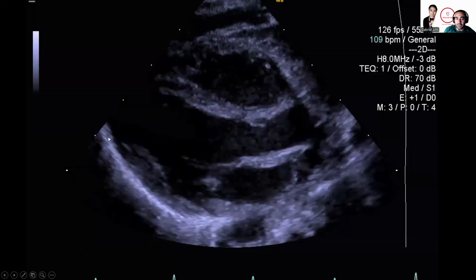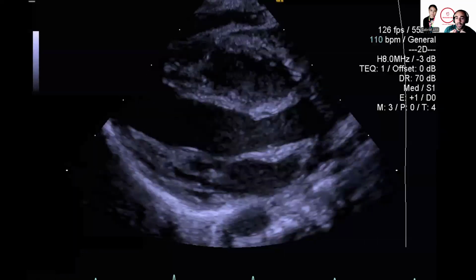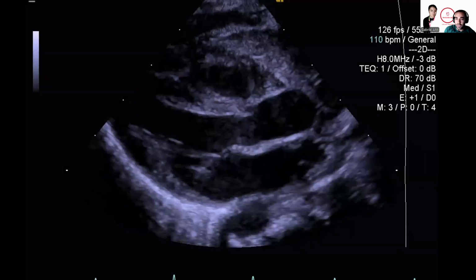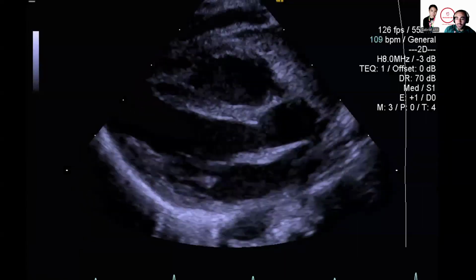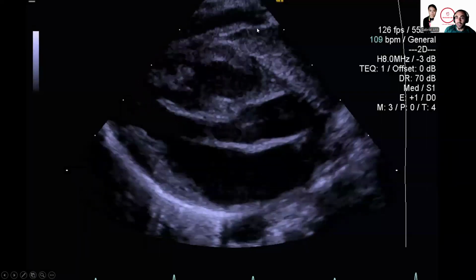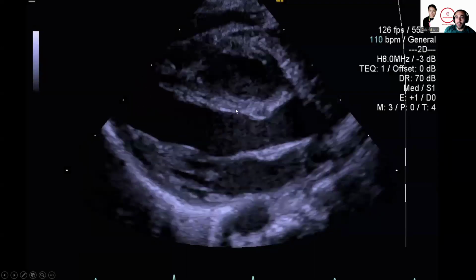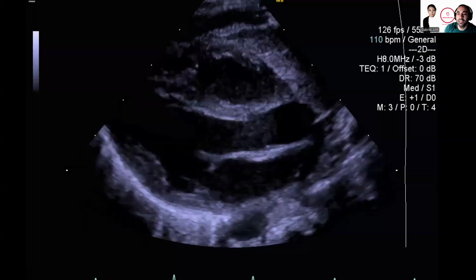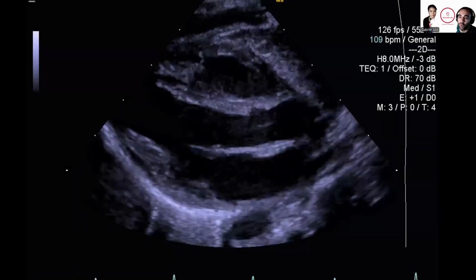This bright line represents the pericardial sac. The pericardium is a very echogenic structure, and so will appear more white. If you're not aware, anything that is dense and will reflect ultrasound will typically appear whiter on the screen, and anything that is not dense or does not reflect ultrasound will appear dark, because the ultrasound beam is going through the tissue and then will bounce back on certain structures, go back to the probe, and the probe is actually listening to that echo from this bounce back, giving us a visual representation of this acoustic or wave phenomenon.